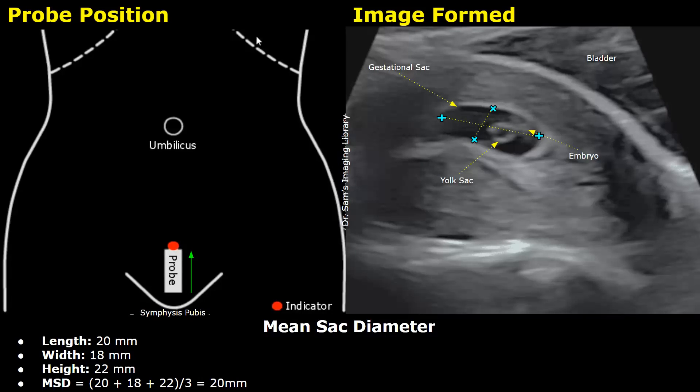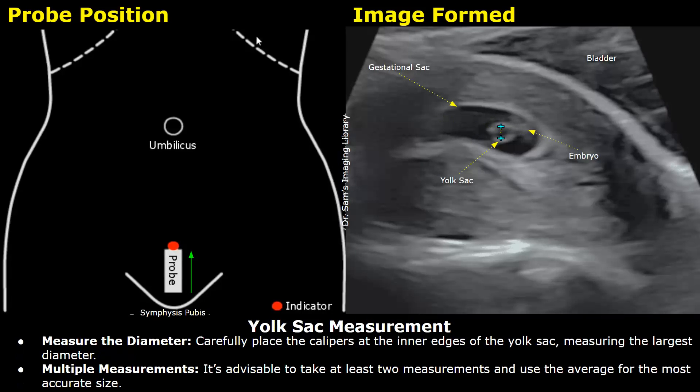At 7 weeks, you should be able to see the yolk sac, and it can also be measured. Place the caliper at the inner edges of the yolk sac — basically the borders of the anechoic, dark area. Measure the largest diameter of the yolk sac. You can take multiple measurements just to make sure it is accurate.